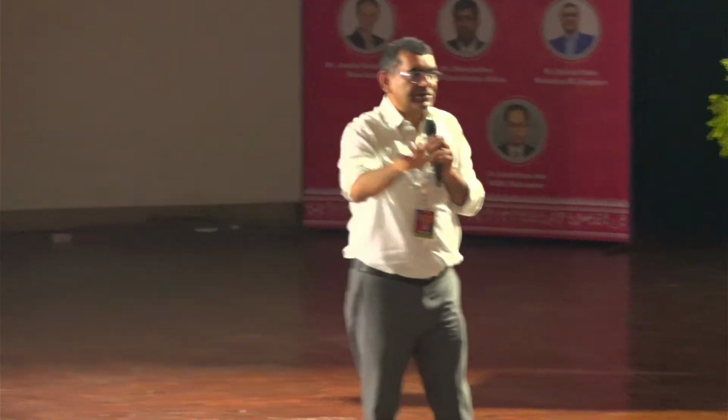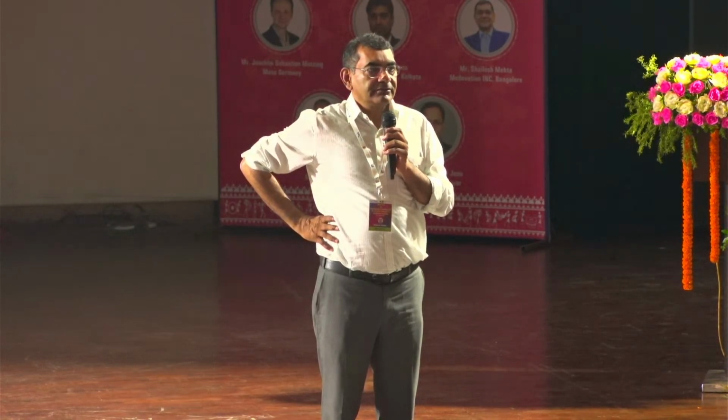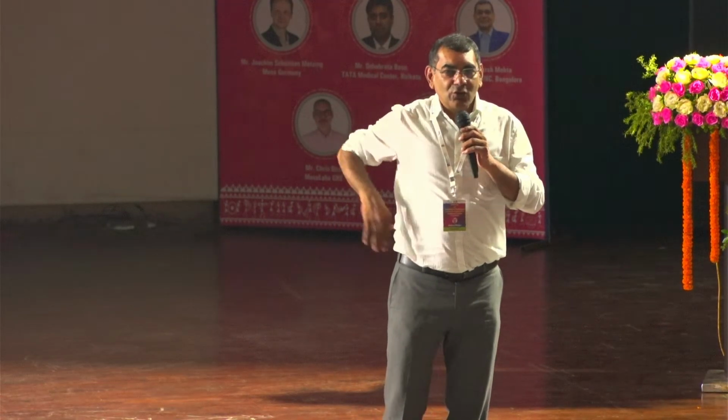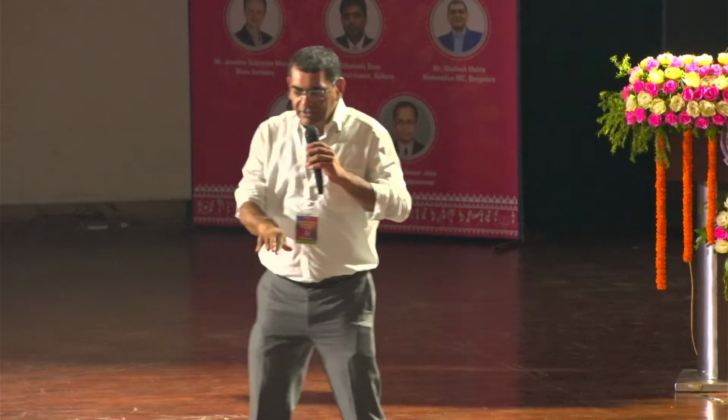Risk assessment, create a problem for the CSSD system, right? First thing is, is the production date and expiry date given? Now see the fun of the Bhubaneswar people. Is the production date and expiry date given? For steam? Yes, sir. For ETO? Yes. 18 months. Plasma? Your Bhubaneswar has educated bacteria. It comes to your hospital, sees steam, ETO, and says, I'll come after 1 year, I'll come after 6 months.